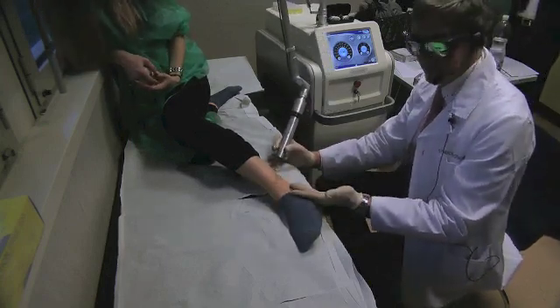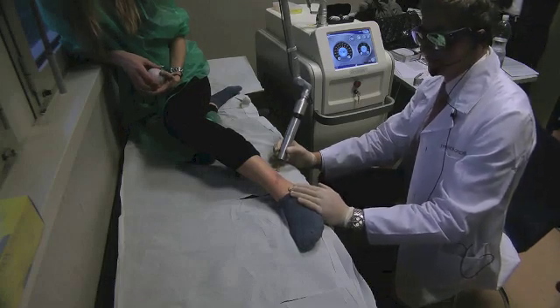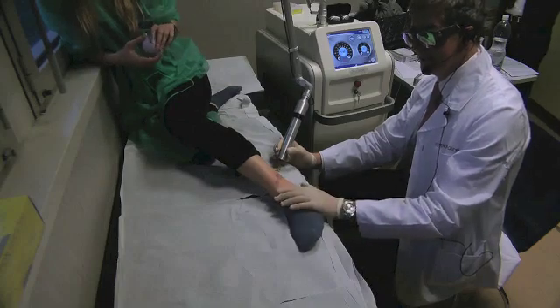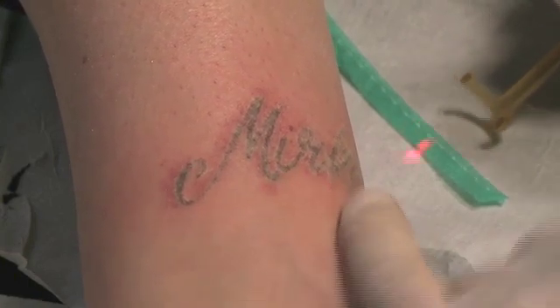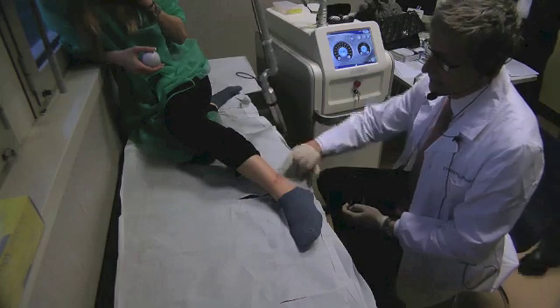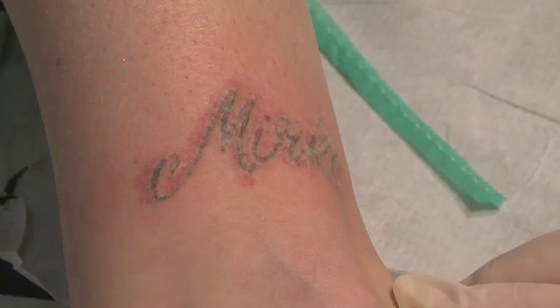Post-treatment: if I had to choose, I would do a mometasone cream, and she would do another day as well. If she felt itching, she would receive a treatment for that. For skin care, I would apply a triclosan preparation to prevent super infection. As you can see, we provide laser safety — goggles can be removed. There is a slight reddening, very little petechiae, no bleeding at all. So there will be no scarring in this occasion.